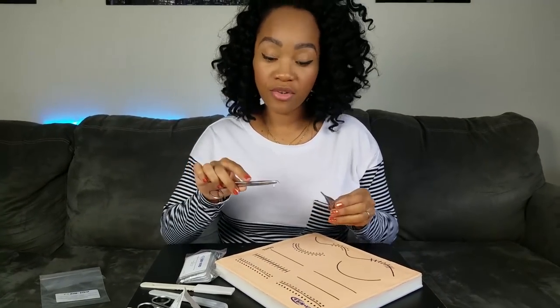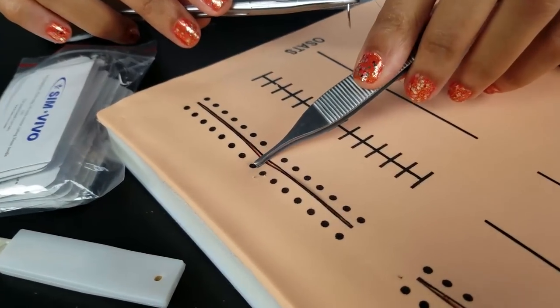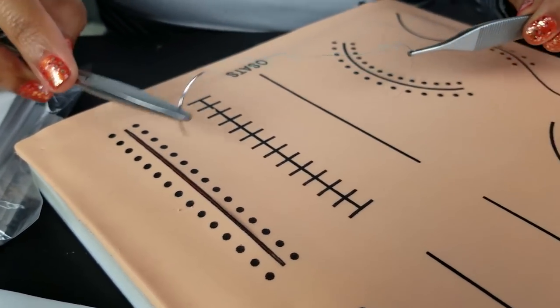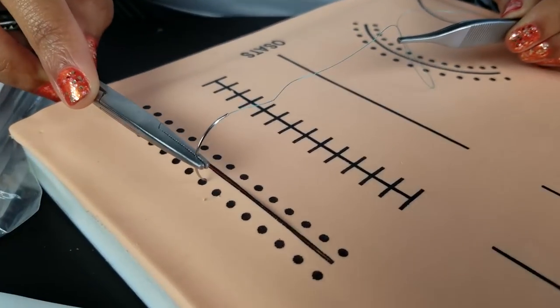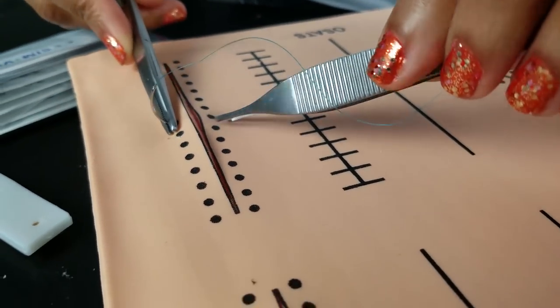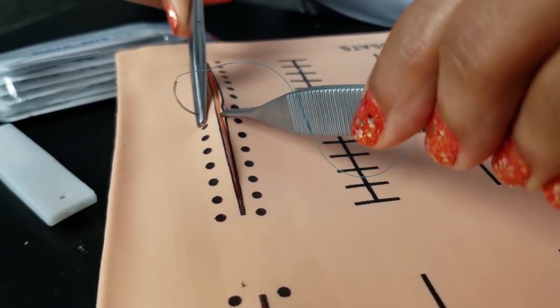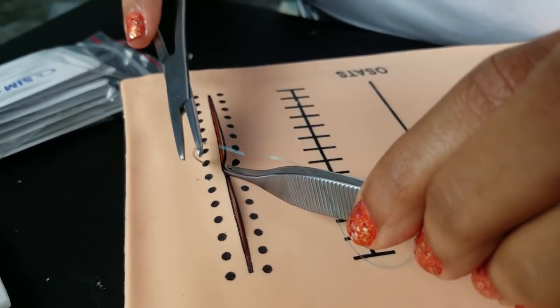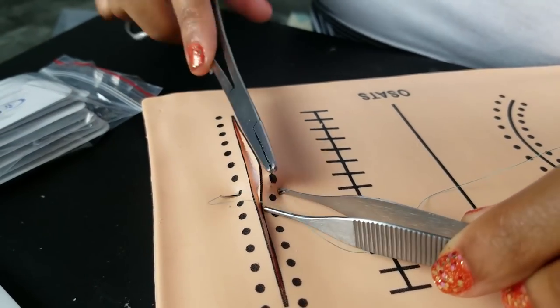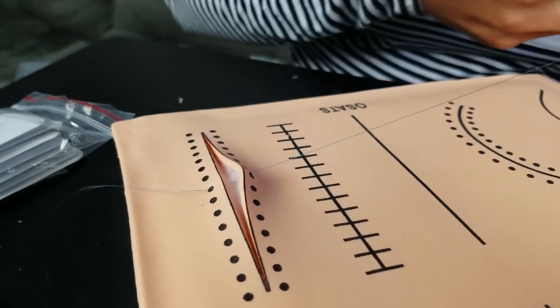We learned you go in at 90 degree angle. You start off in the middle, so that is what I'm gonna do. I'm gonna start off right here at this little dot. I'm gonna pull this back, give myself a little bit of room to work. All right, so at this dot, you go in 90 degrees, pull it up, right? So I'm in there, I'm getting into the subcutaneous fat tissue. All right, so I see my needle and it's going in the wrong, oh, there it is, right in there. So clearly this isn't supposed to happen. I'm not supposed to stick that right there. Like I said, you guys, novice learning, but I'm pulling it through.